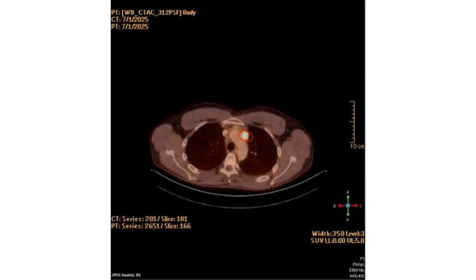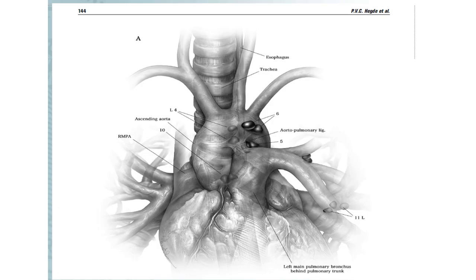The next one is the para-aortic station 6 here, as you can see. So this is a view from the front of station 6. You can see the esophagus here, right next to the trachea. We try to access this from this window medial to the subclavian. I'll show you a video of how it's done in a little bit.